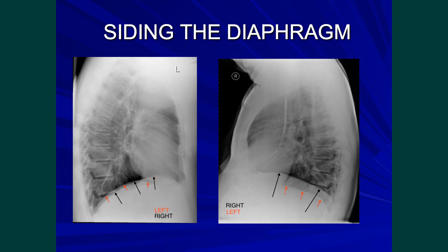The left hemidiaphragm on the other hand stops at the cardiac silhouette, and this is because the heart shadow has the same radiographic density as the diaphragm.